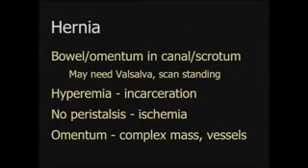Hernias are very common, and they may contain bowel or omentum within the inguinal canal or even extending down into the scrotum. It's important that you have some sort of pressure in the abdomen, either with Valsalva or if it's a young child that can't cooperate, I've even scanned these children standing to try to increase abdominal pressure to make a hernia appear. If you see hyperemia of the bowel, you need to think about incarceration. If there's bowel but has no peristalsis, you need to think about ischemia.